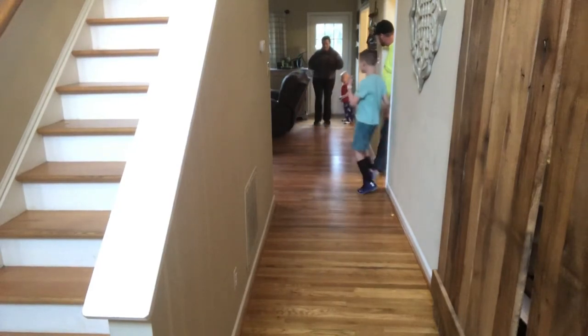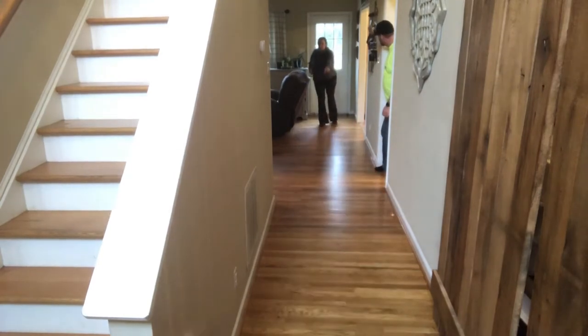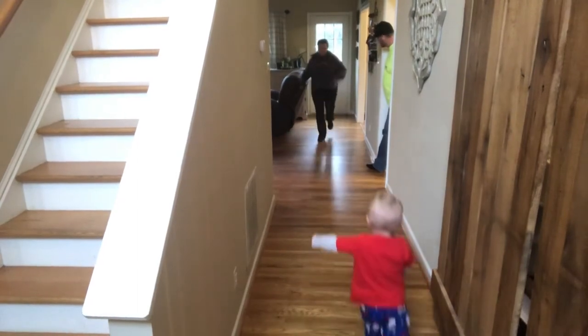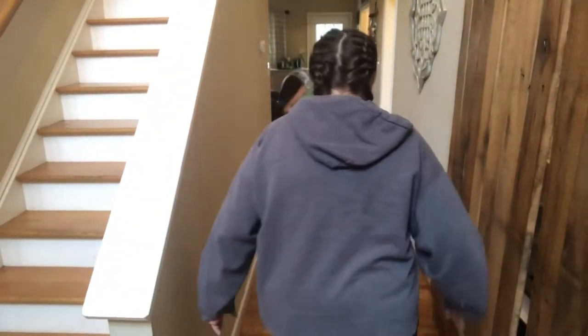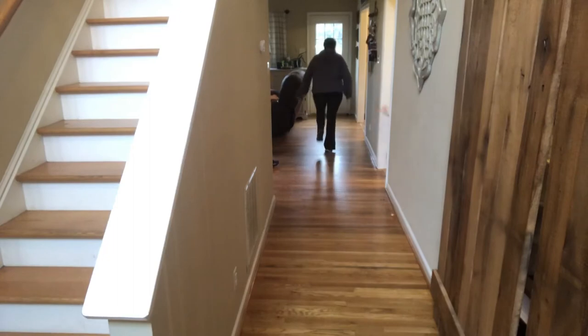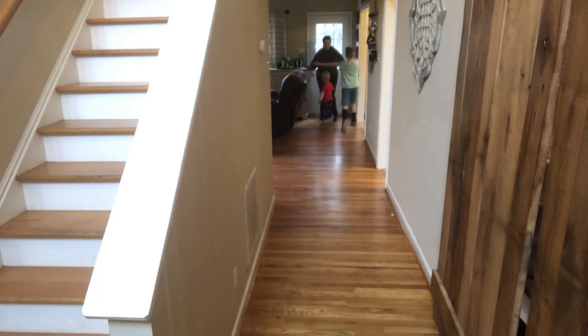I need to try to — instead of that short army stepping, I need more space, longer strides. I'm trying to do longer strides so I'm not so army stepping. Okay, ready? Yeah! Oh yeah!